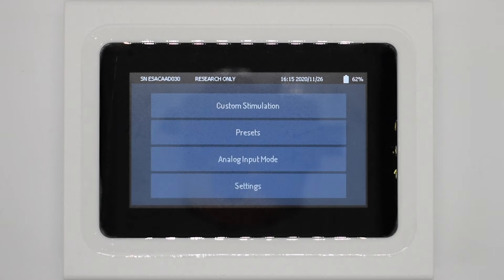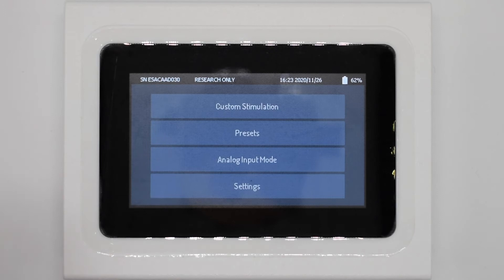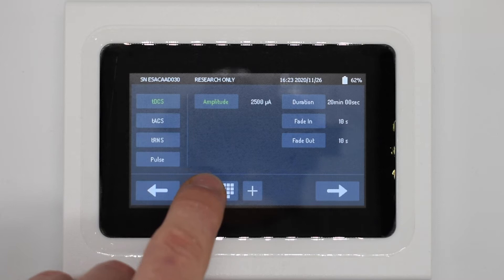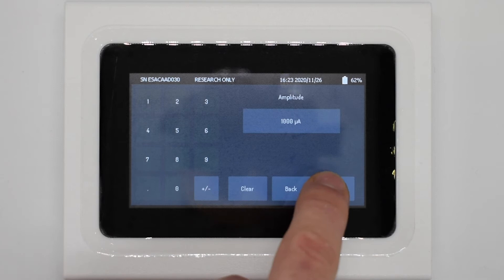Selecting custom stimulation, you can see the first screen presented. On the left-hand side we have our four stimulation waveforms, and in the middle and right-hand side we have each of the parameters which can be changed. The first selected is amplitude, which can be changed by pressing up or down arrows or selecting the keypad and typing in a number. Duration, fade in, and fade out can each be changed the same way.